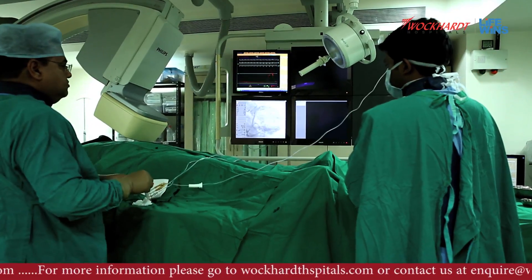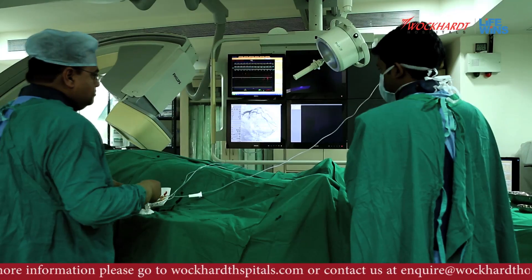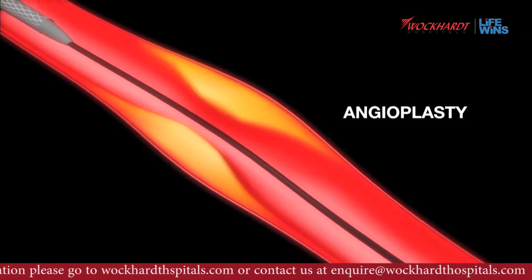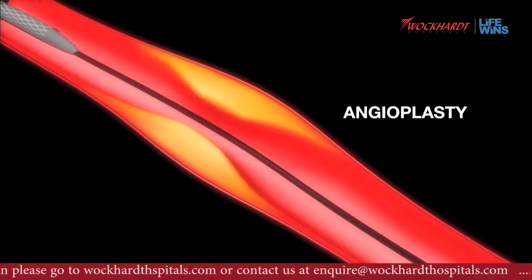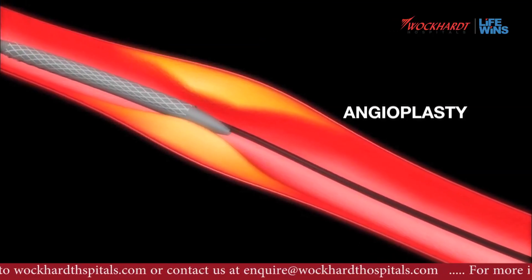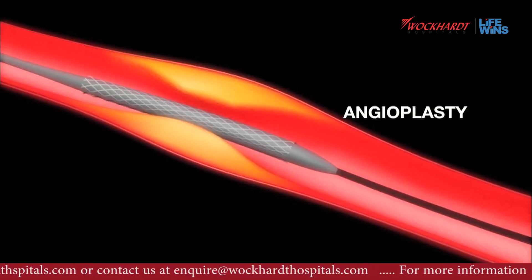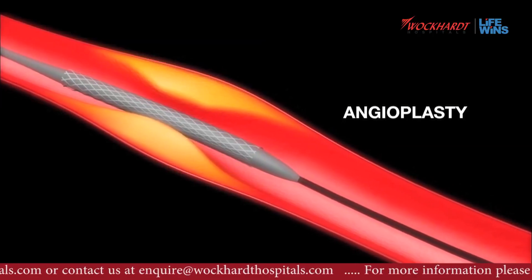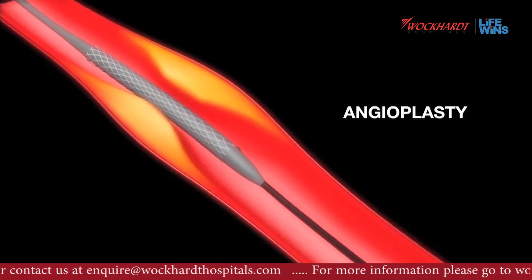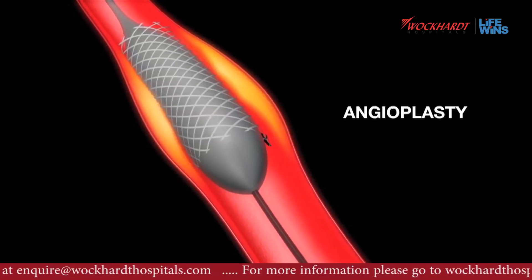We see various projections and angles — around 7 to 8 of them — to confirm the severity. We need to put a stent from here to here so that this becomes flowing and normal. That is called an angioplasty. We put a metallic mesh tube. The procedure is similar — this is the catheter, we put a wire across and put the stent inside so that this diameter actually increases.